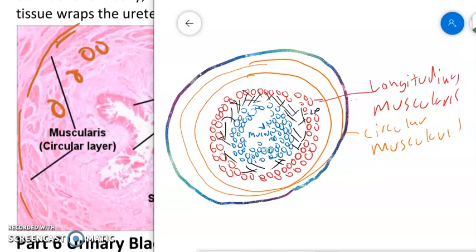And the difference between a serosa being the outside layer, like in an intestinal tract, and the adventitia, like here in the esophagus and the arteries and the veins, is a serous membrane is going to have a second part of the membrane and fluid around it. This does not. So this is why this is an adventitia and not a serous covering. I personally like just to call it the external layer, but I cannot do that. So this is the adventitia.